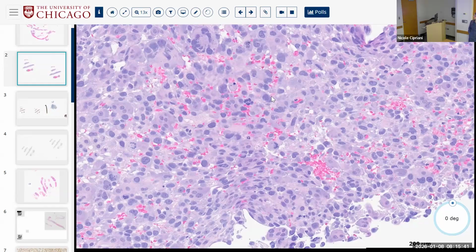Does the number of mitotic figures cause you pause for those, right? Because those two are supposedly benign. There are some suggestions of malignant giant cell tumors, right? But are those really malignant counterparts of giant cell tumors, or are those just giant cell rich undifferentiated sarcomas, right? I think that's the question.